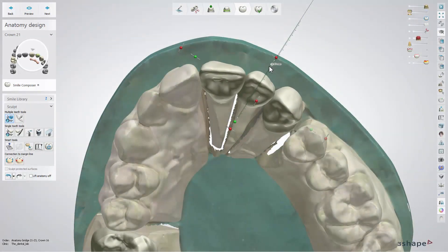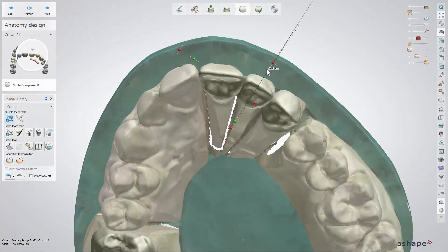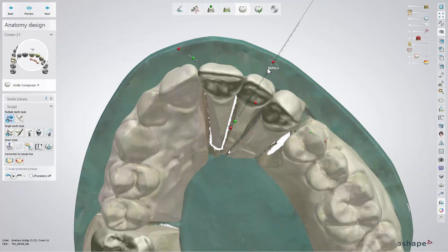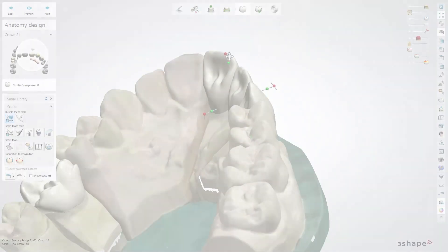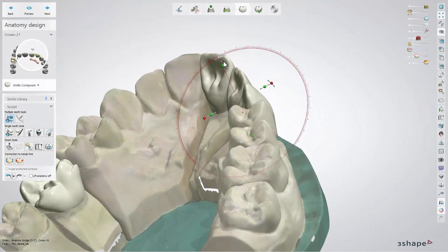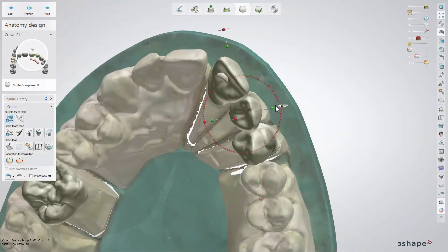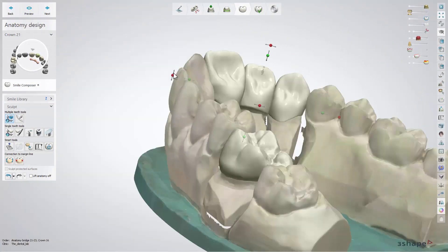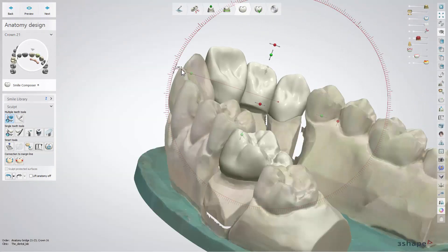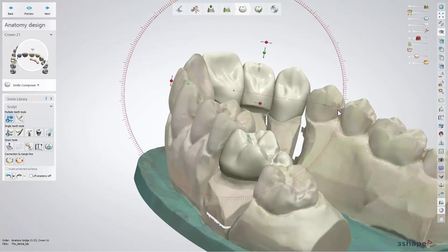Holding down Control and Mouse switches the scaling mode from one direction to proportional. Depending on the view, tilt and rotate the teeth by clicking and dragging one of the red points. The adjacent arrows illustrate the direction of the orientation.